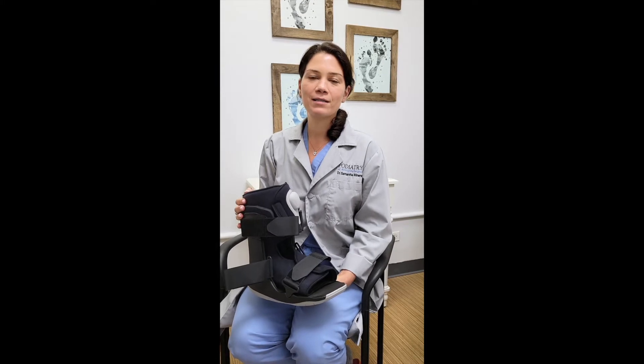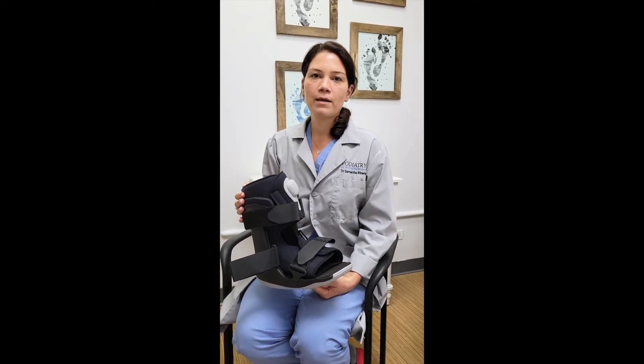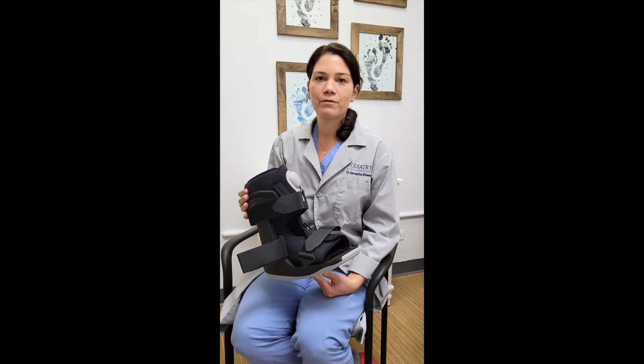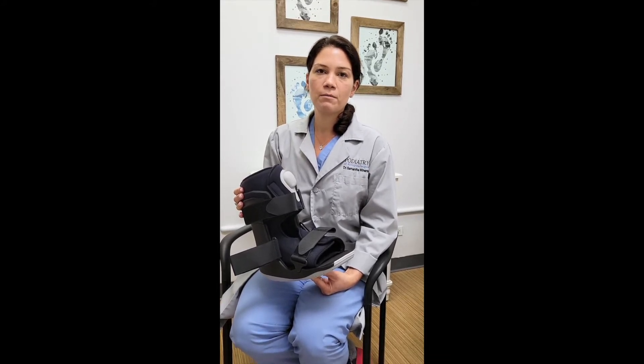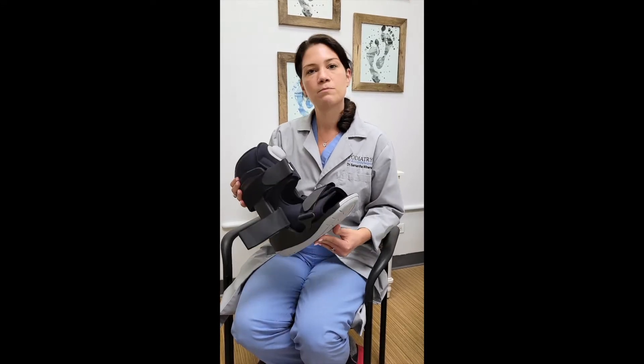Hi, I'm Dr. Weinerman and today we're going to be talking about the cam boot. Your doctor might prescribe a cam boot for a variety of different reasons including tendinitis, fractures, or ankle sprains. There are a lot of reasons why your foot would need to be immobilized and pressure would need to be reduced in different areas, and this boot can do all of that.